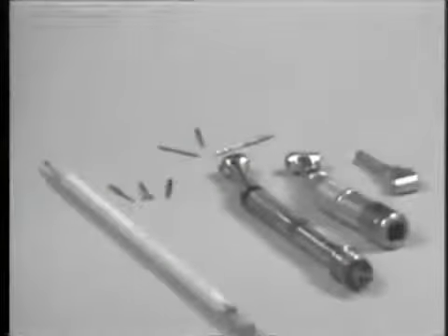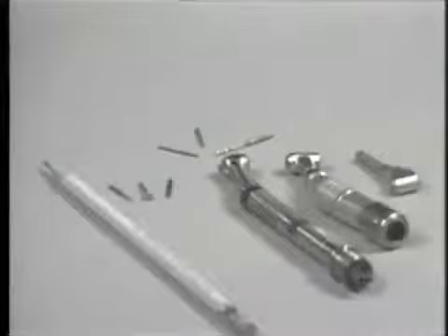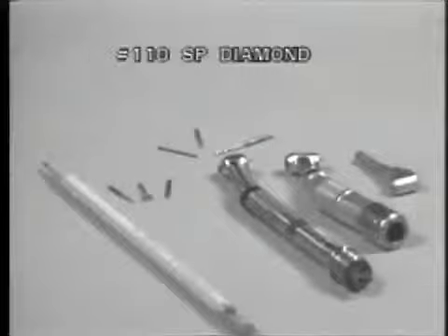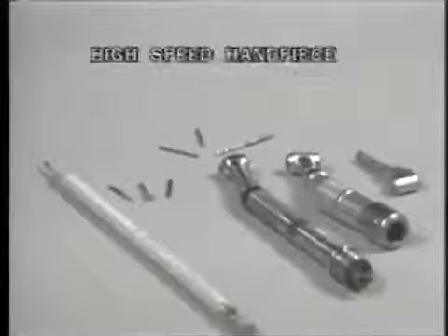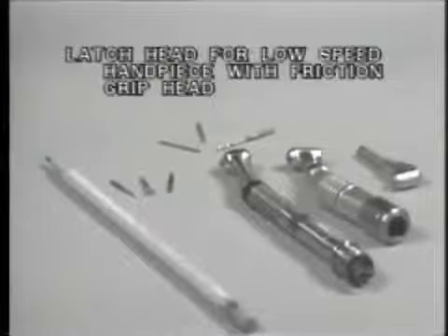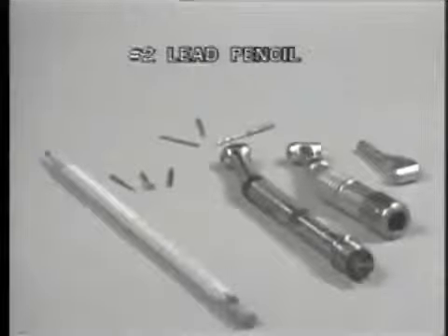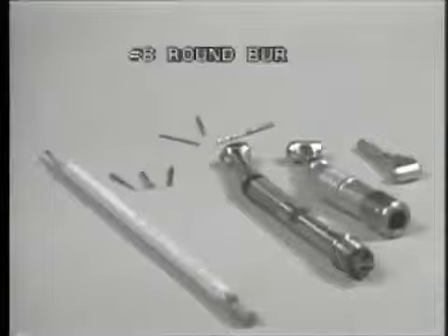The materials required for the initial reduction and preparation of the overdenture abutment are: a number 700 tapered fissure burr, a 110 SP diamond, brass shank tapered finishing burr, a high-speed handpiece, a low-speed handpiece, a latch head for the low-speed handpiece with friction grip head, a number 2 lead pencil, a Parapost endodontic post system, and a number 8 round burr.